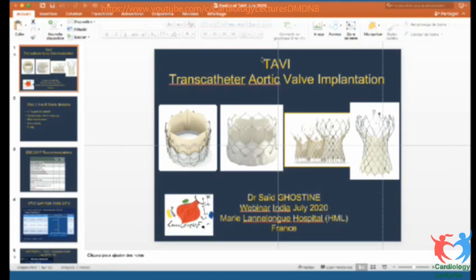And sometimes you ask your colleague, surgeon or cardiologist, what he prefers. Sometimes he would prefer this valve or that valve. You have to check everything and deal with the heart team. The heart team is here to protect you and protect the patient. TAVI is not a two hands work; it's a four hands work. You are usually two operators, so you have to work with the same person. If you want to deploy the valve, you have to tell him to deploy very slowly or quickly. You have to be aware that the nurse who will do the rapid pacing understands your vocabulary.